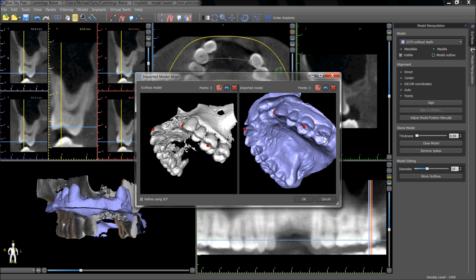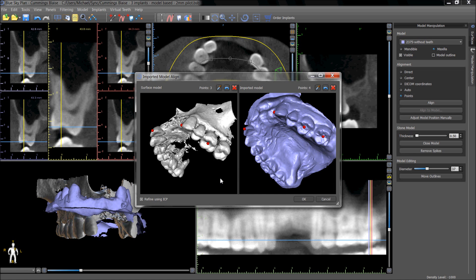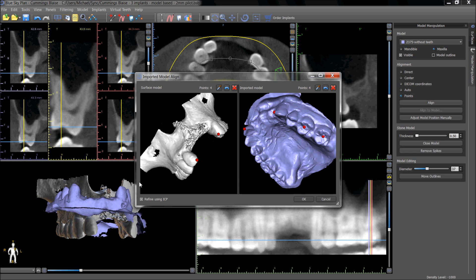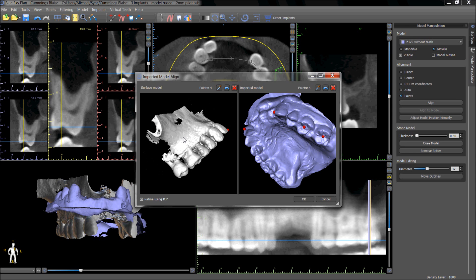At least 5 points should be placed, but the more points placed, the better and the more accurate the merge will be.